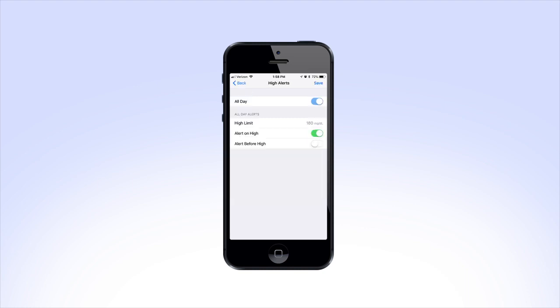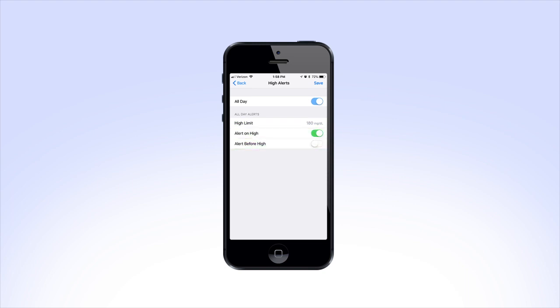Tap on High Alerts. You'll see the option to set your high limit, alert on high, and alert before high. You'll also notice you have an option for your high alerts to be the same throughout the day using the All Day feature.